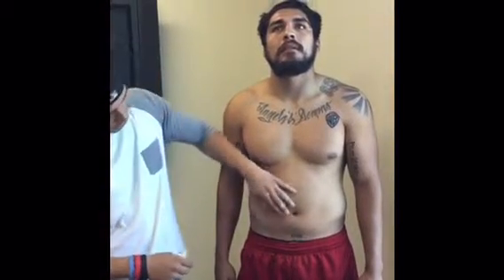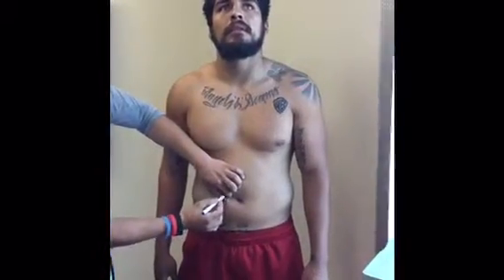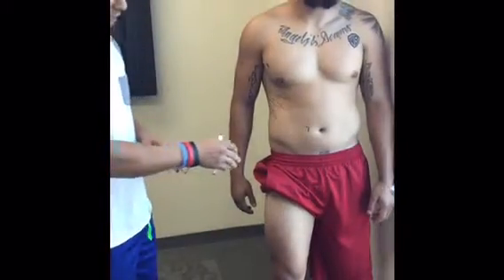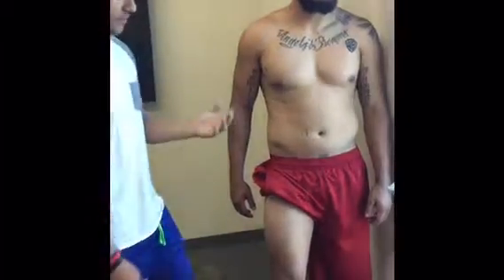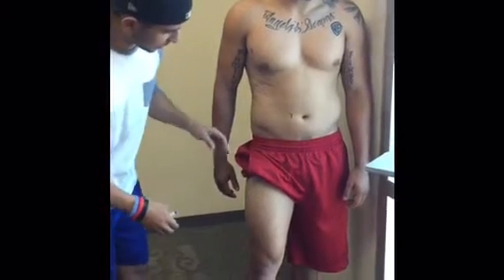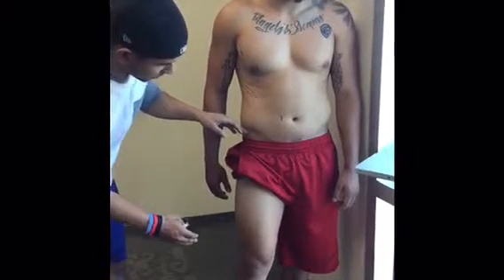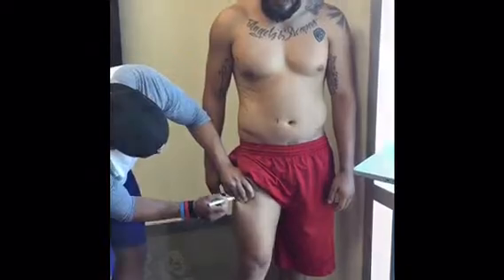Okay guys, so the sixth site that we're going to be taking is the abdominal. It's a vertical assessment. So we're going to go 2 centimeters away from the umbilicus. Okay guys, so the 7th site is a little bit special, so we want to make sure that the patient has all his body weight on the left side of his body, left side of his foot. That way the skin is nice and relaxed. We're going to be taking it from the midway point between the hip and the patella. So right about here, vertical assessment.